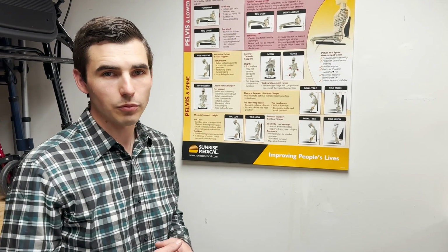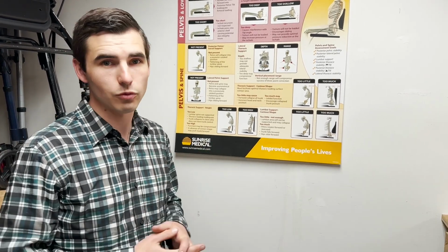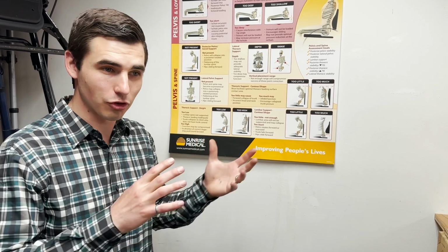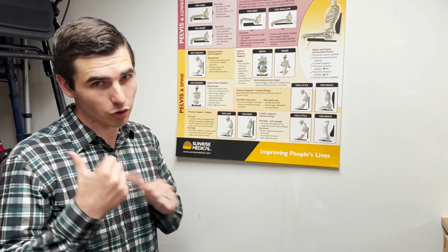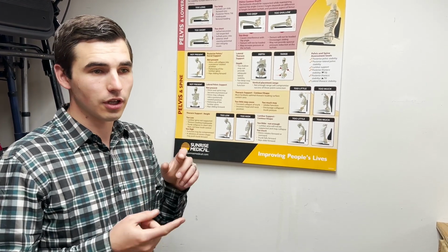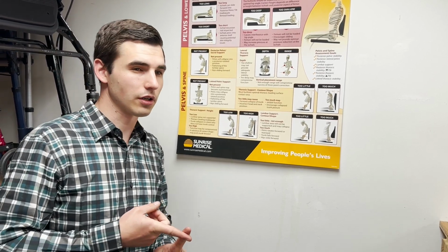Okay, in these examples in this discussion, we've been considering the typical human body. And what happens when we're not working with that typical human body, but we're working with someone whose body is shaped a little differently? Well, a lot of these rules go out the window, and you're going to be focusing on different guiding principles. Is the condition permanent or is it temporary?